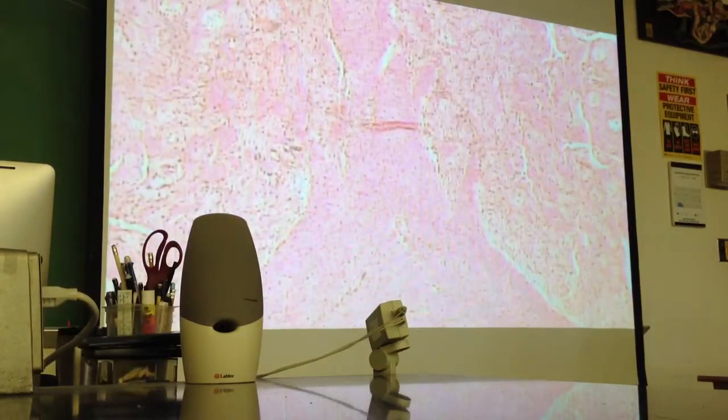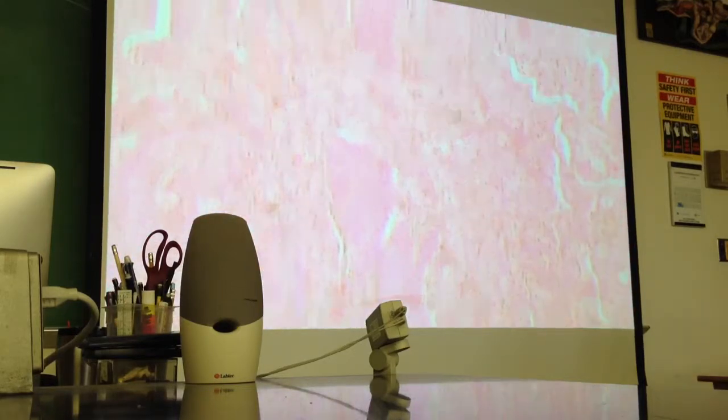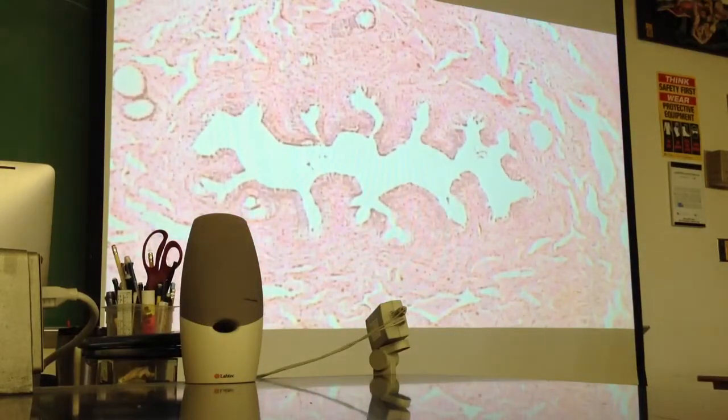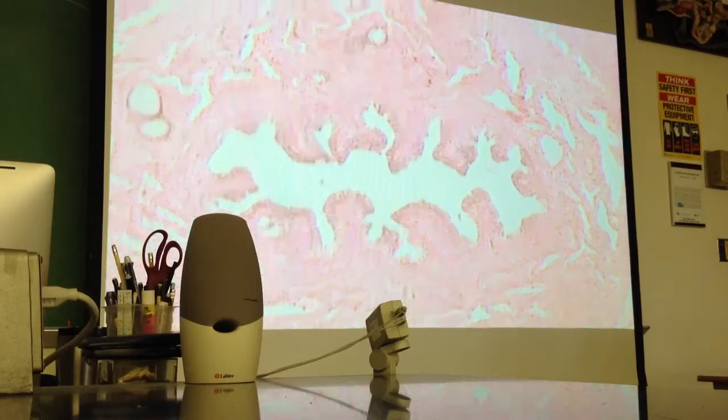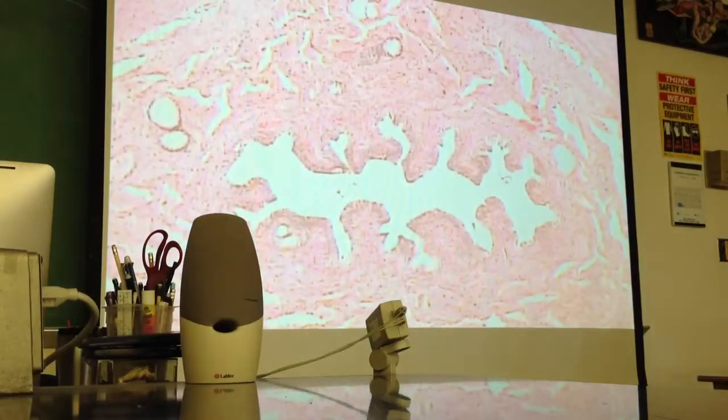So for this, obviously, if you put it on your microscope, it's not going to be this zoomed in, so you will be able to see at least the corpus cavernosum together, or the urethra inside of the corpus spongiosum. Okay, so make sure you take a look, or at least you understand how this would look on your slide if you don't want to come snag it. And yeah, that's it. Any questions about this one?